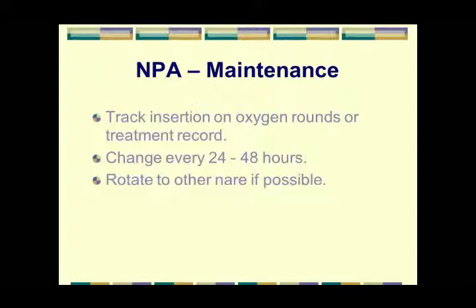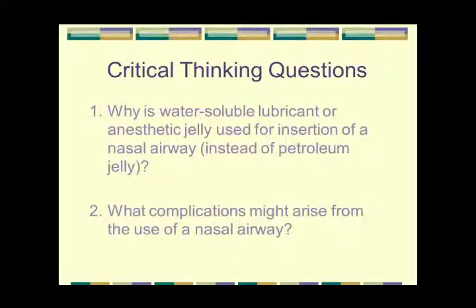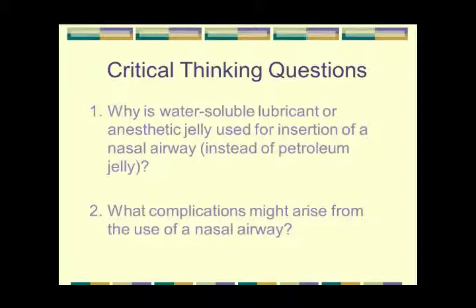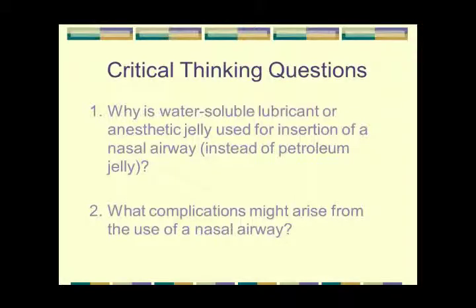Maintenance of them, you change them every 24 to 48 hours. And obviously, the ideal is to rotate it or use a new tube in the other nostril. Removing it, just again following natural curvature, it'll slide itself back out again. Why do we use water soluble instead of petroleum? You don't want to have any petroleum inhalation, absolutely.